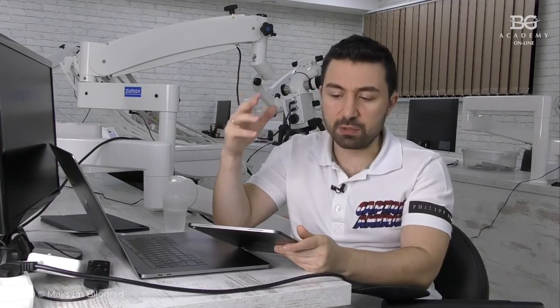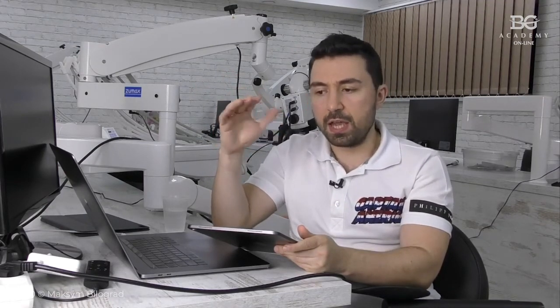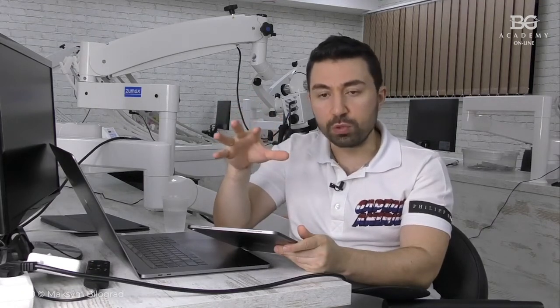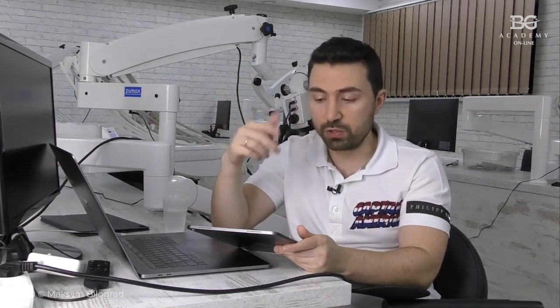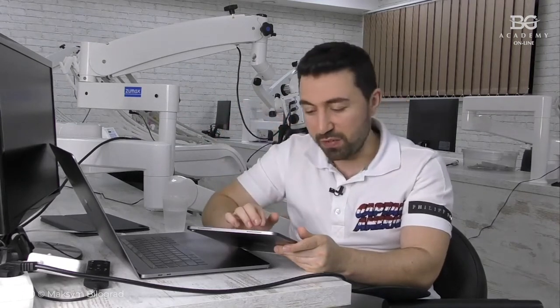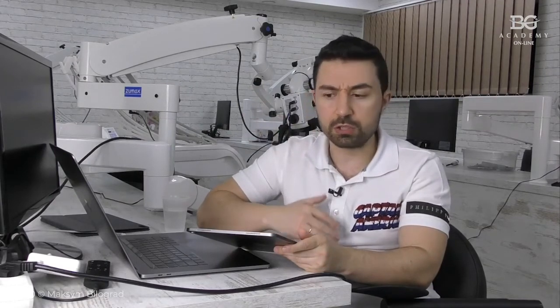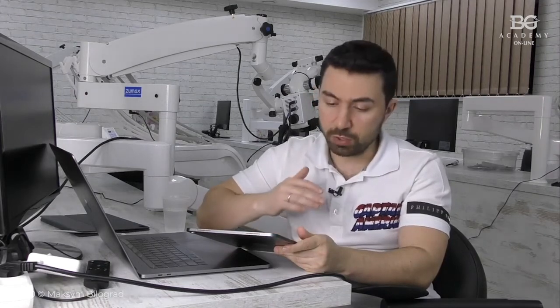And others say that you can have the opposite tooth touching the ceramic surface. And these two groups of people, they don't like to get occlusal contact in the area of junction between a tooth surface and veneer surface on the opposite tooth. And there is a third point of view, they don't care. So you can just do whatever you want, but you have to get stable occlusion, no super contacts, good protrusive movements, good lateral protrusive movement, canine guidance, so that will help.